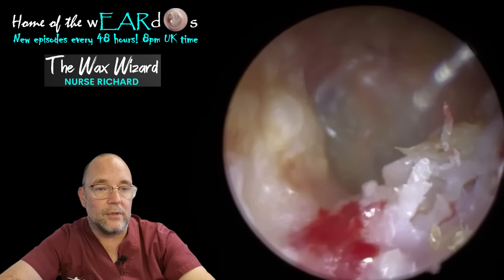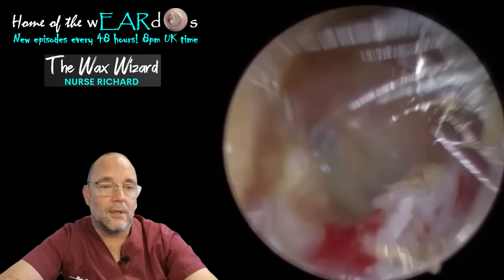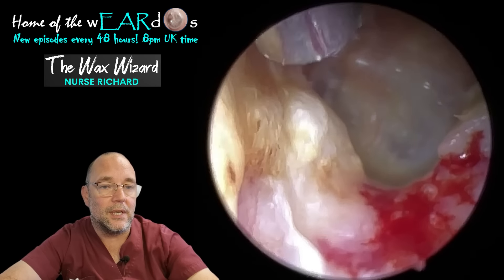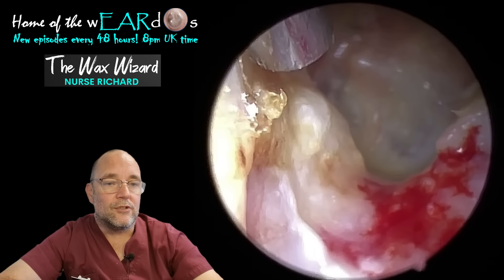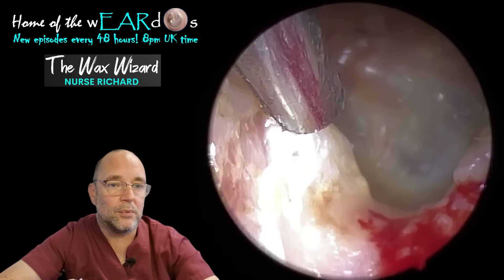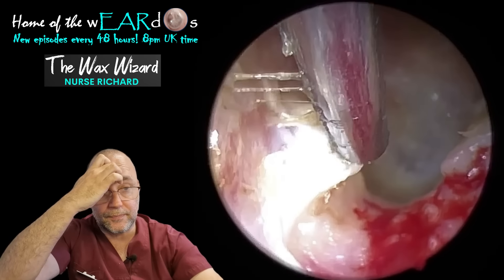And it's when that bit disappears - there you go, just gone now. Can you see the little bit of blood at the bottom there? So obviously I stopped at that point. Just have a good old look to see what's going on. And obviously it's revealed this huge crater that's now bleeding. It didn't bleed excessively. You were watching it yourself - it wasn't because we bumped into the ear canal or touched something we didn't with the tube. It's just that as soon as the skin has been lifted off, it just opened up a tiny little blood vessel, and that's what caused it to bleed a little bit. But it didn't bleed much, and I wasn't concerned about that. I was fully expecting it, to be honest with you.